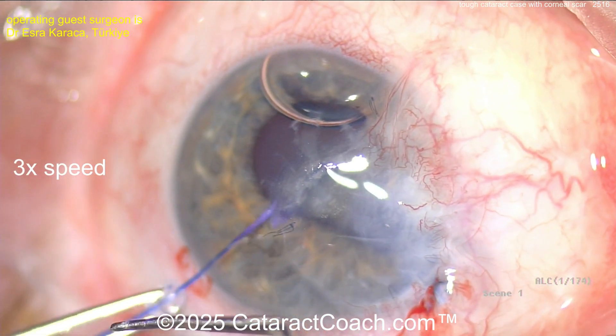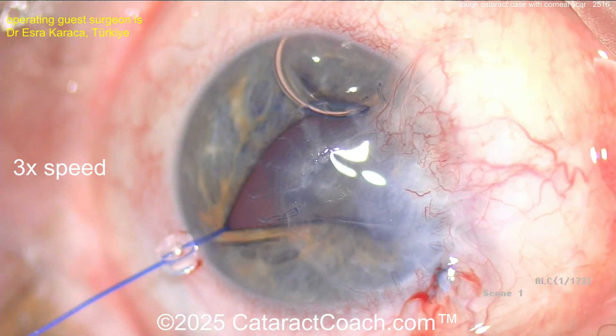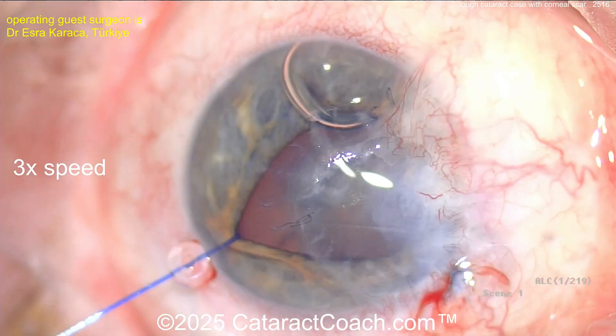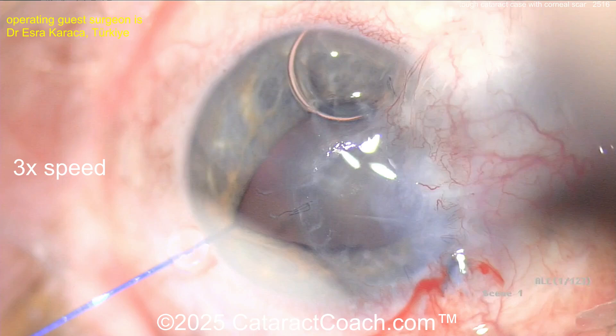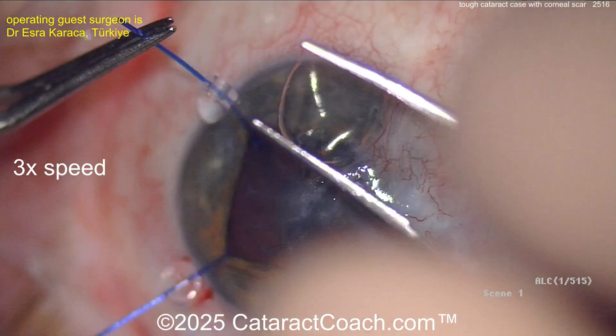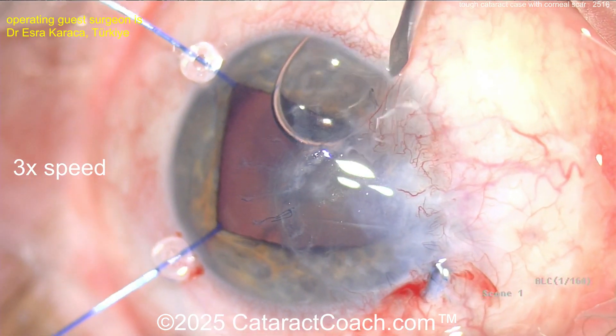Putting in some iris hooks — I think that's a wise move to expand this pupil, which is probably very important. You can see there are some synechiae there, and you may also have iris plugging up that corneal perforation at the nasal limbus. Be very cautious: if you yank that iris out of there, you may have a repeat of that perforation.